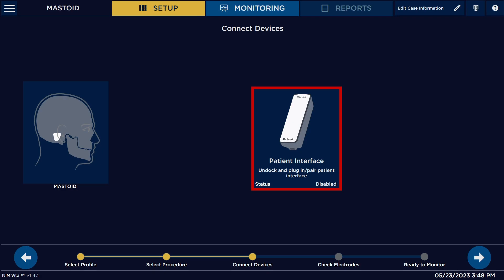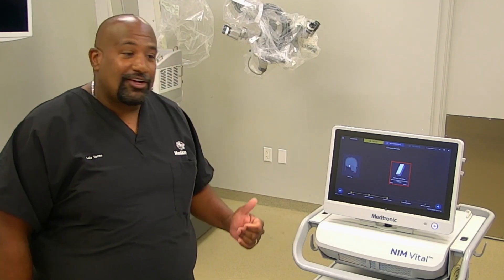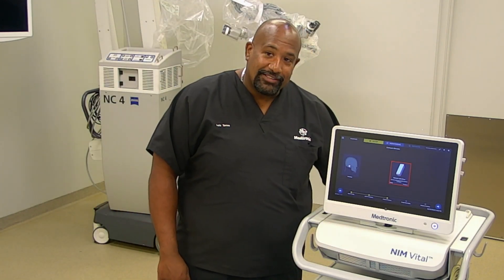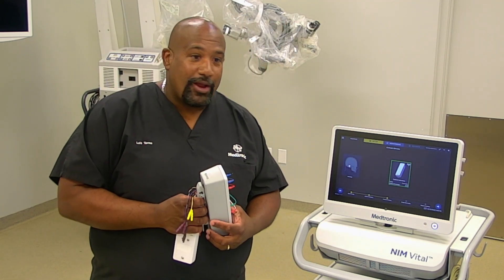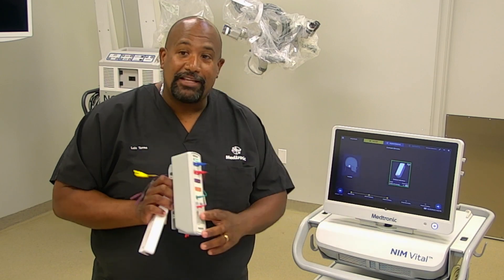Now it's asking us to undock our patient interface, so we're going to undock the patient interface. You'll notice our red square became a green square, which means that our interface has been seen.